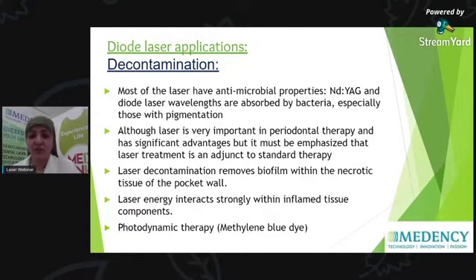As we know, most of the lasers have antimicrobial properties, such as Nd:YAG and diode laser wavelengths. They are absorbed by bacteria, especially those with pigments, as we know, and Dr. Amr said to you all that the diode laser chromophores are pigments, melanin, and blood. And also the laser is very important in periodontal therapy and has significant advantages.